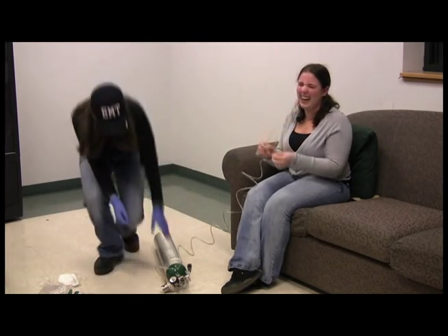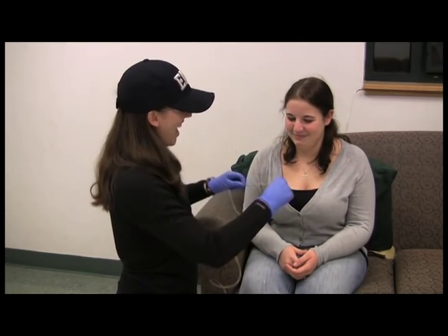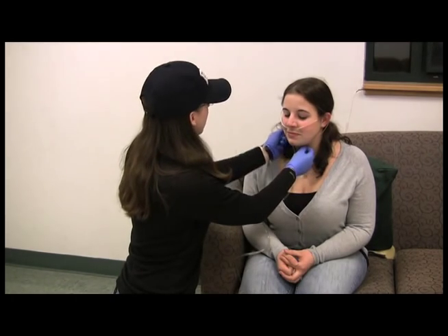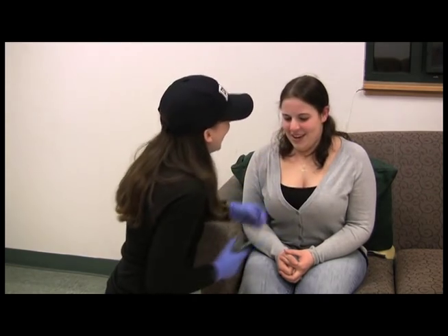You can take it off. Once we have it running, it actually goes this way. Is just discontinue by taking off the nasal cannula.